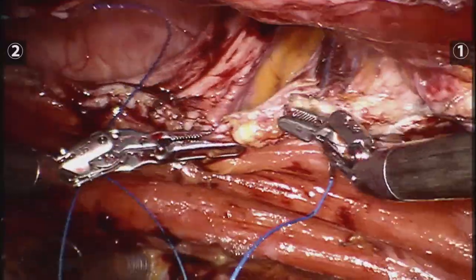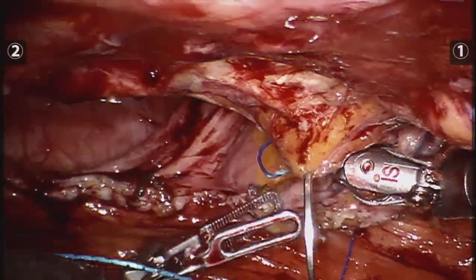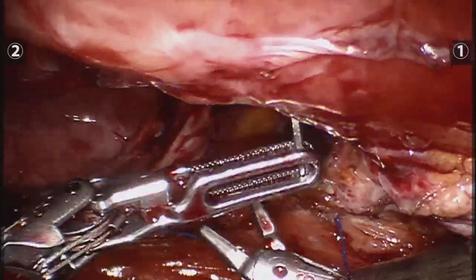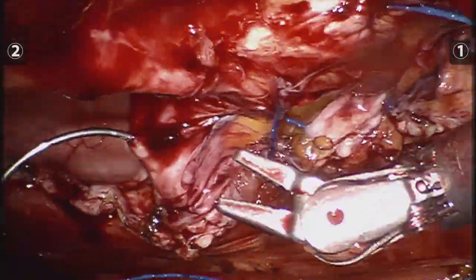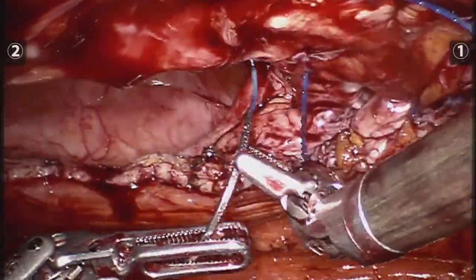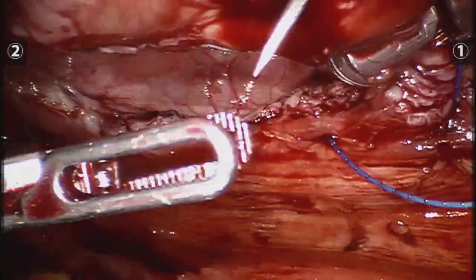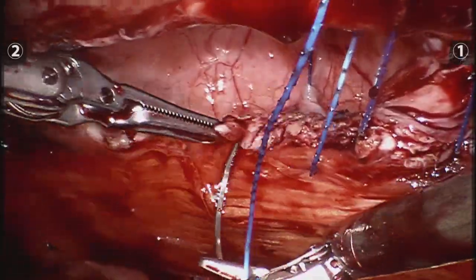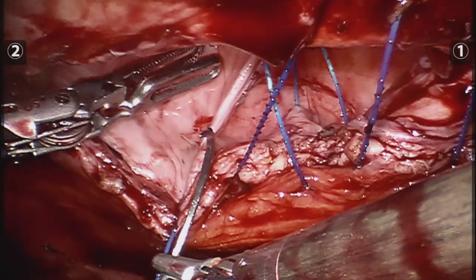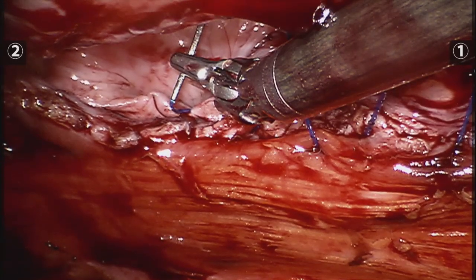There I'm doing my final throws and making sure the suture is nice and locked. I start at the bottom of the other defect using basically the same technique applied on the other side, taking small bites of the peritoneal sac and having my assistant confirm I didn't grasp the skin while throwing the suture — very important to prevent any injuries to the skin and also to help the sac contract and prevent further seromas.